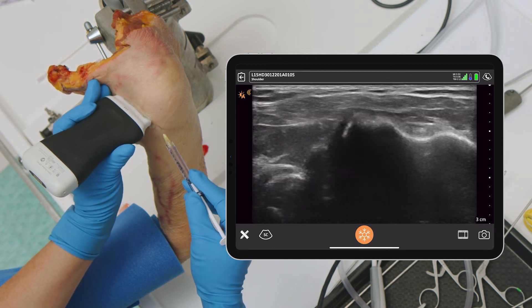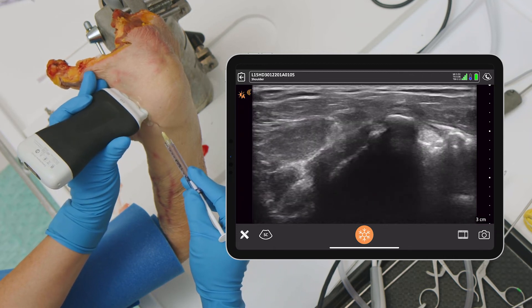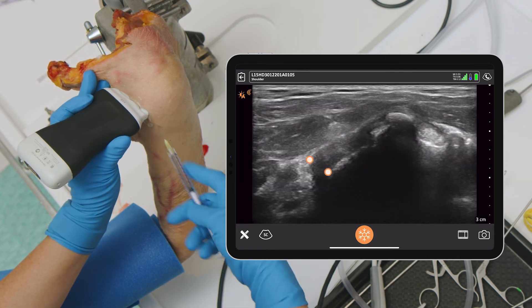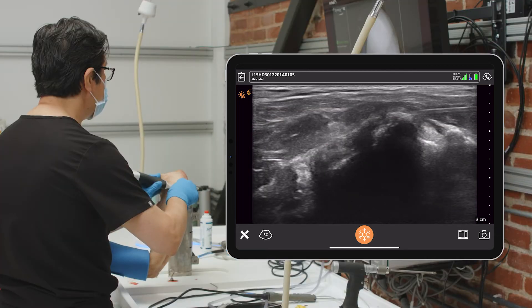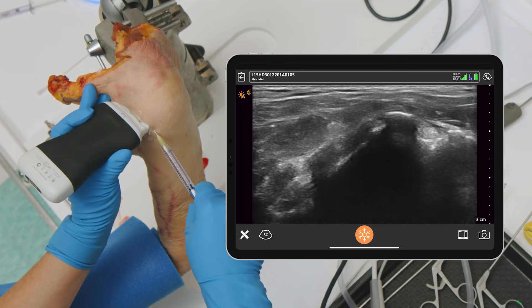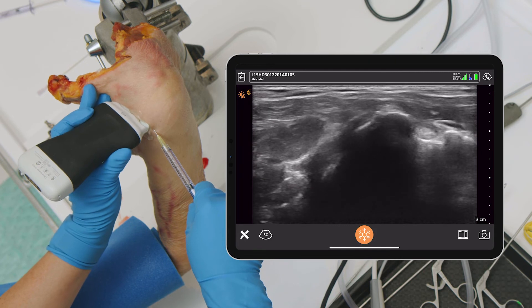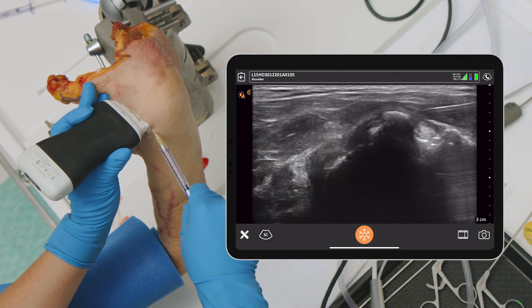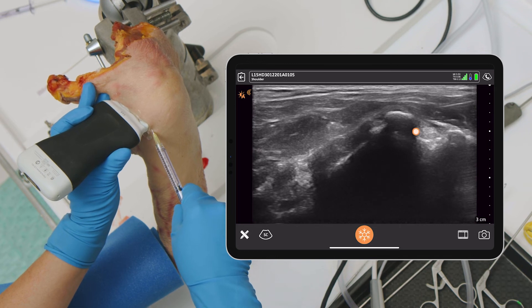The other thing you can also do is if we come up you can get to the subscap. So if you ever wanted to check the subscap and do an injection for the subscap — there's the subscap. You can easily just inject the subscap right there. You can see I'm just right in that region right there. There you go — see the needle really well there. And you can see I'm right at that lesser tuberosity where I want to be.